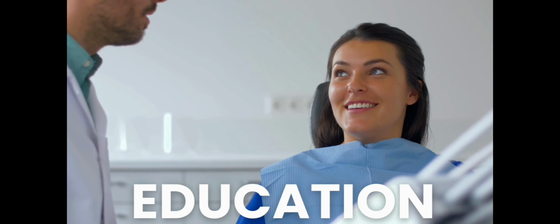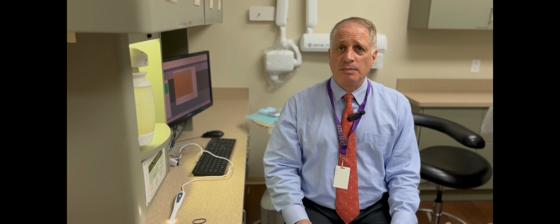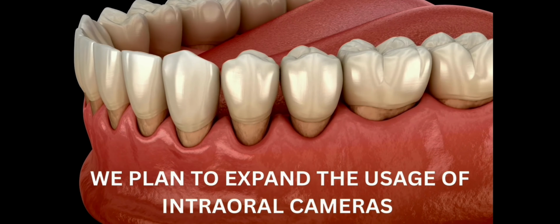Education. As an oral hygiene adjunct, take an image of plaque buildup, for example, on the linguals of lower molars. Then we could use that image to show the patient where they need to focus their oral hygiene efforts to remove the buildup. We plan to expand the usage of these cameras for every dental exam and hygiene visit, before and after.